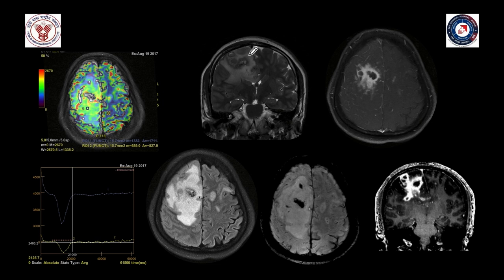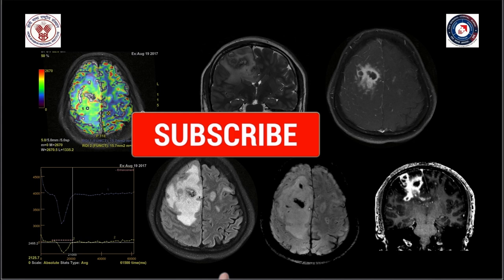However, upon craniotomy the surgeon found frank pus — this was a cerebral abscess. This is a pitfall of DSC perfusion: cerebral abscesses can show spuriously high perfusion values due to reactive angiogenesis in the adjacent brain parenchyma. Retrospectively, fluid-debris levels were visible in some of these lesions. Sometimes diagnosis is quite difficult to make prospectively even with adjunctive techniques like perfusion-weighted imaging.